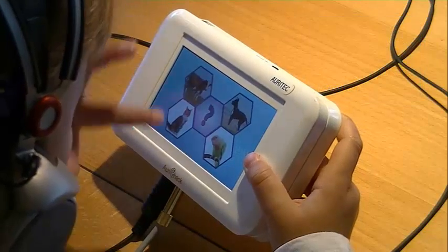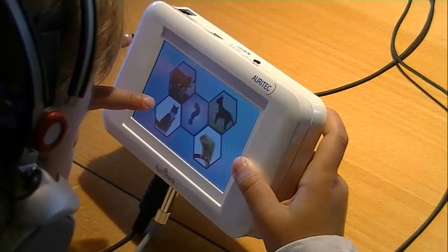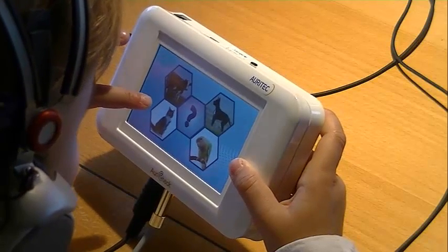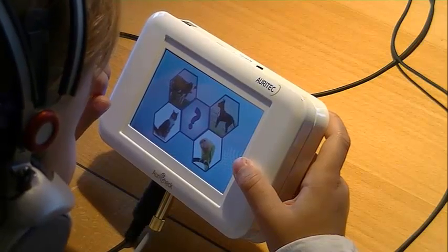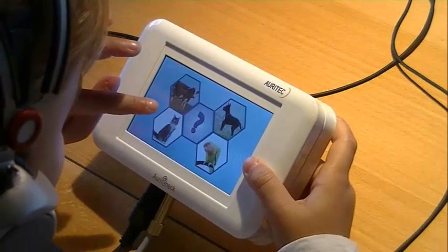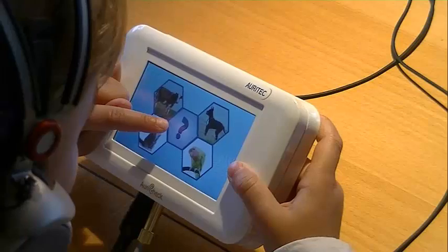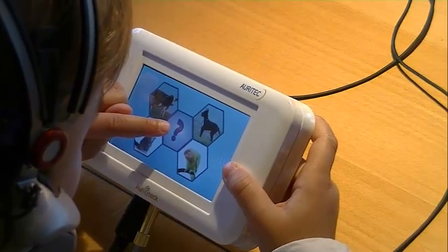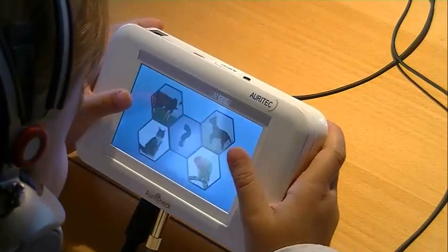After pressing the question mark, the signal level for the corresponding animal sound will be automatically increased by 15 dB for the next presentation to ensure that it will be heard again. If the corresponding sound is identified correctly again by the following presentation, the signal level will be automatically reduced in 5 dB steps until the question mark is pressed once more.